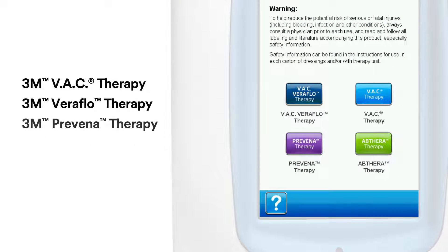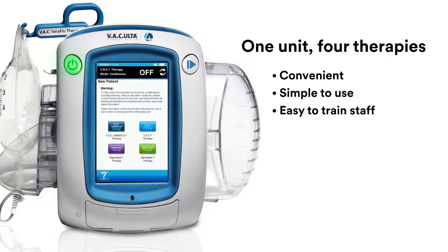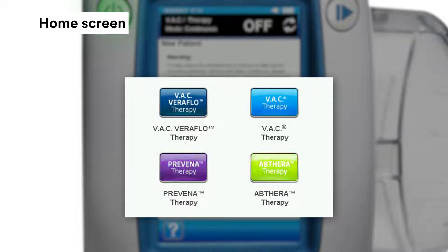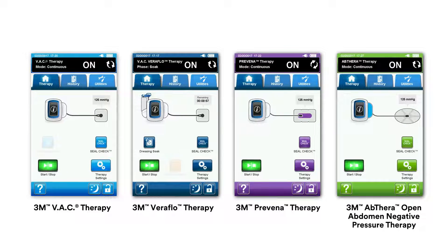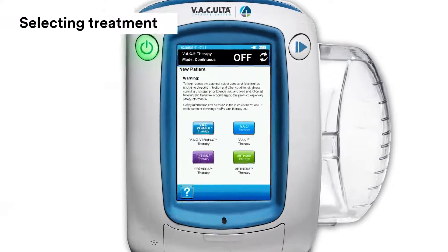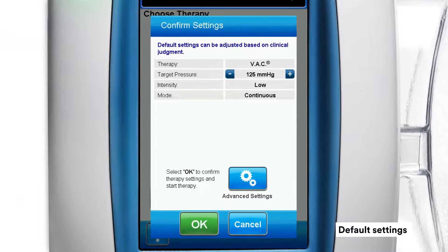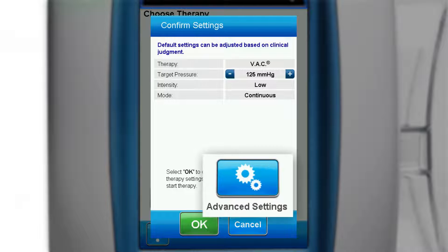So one device manages all your negative pressure needs, simplifying processes and making it easy to train staff. The home screen includes four color-coded buttons, one for each therapy. When you initiate a therapy, that therapy's specific color coding frames the screen. To select a therapy, press the associated therapy button. A confirmation screen appears showing the therapy's default settings. You can use the plus and minus buttons to change settings if they are an available option. Settings that do not include plus or minus buttons must be changed using the advanced settings button.